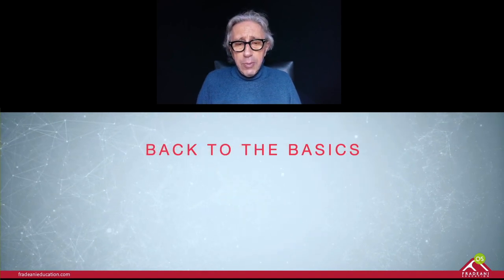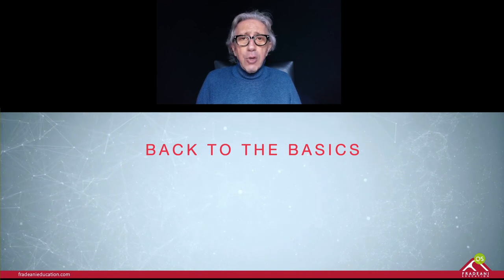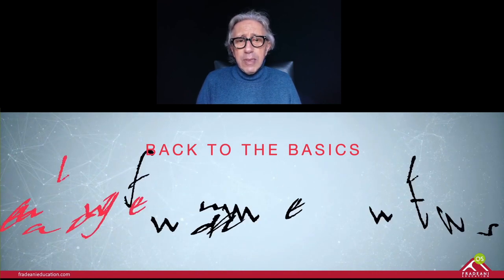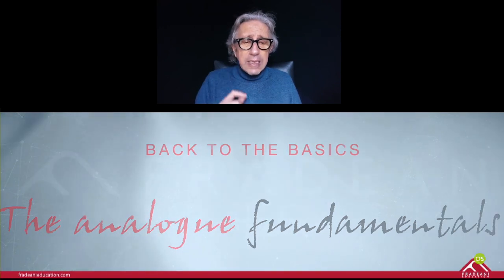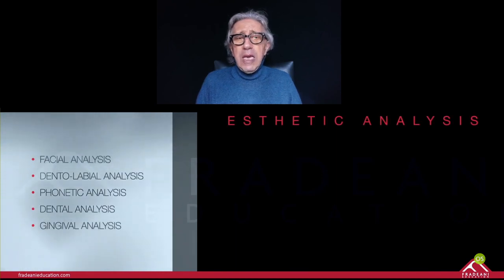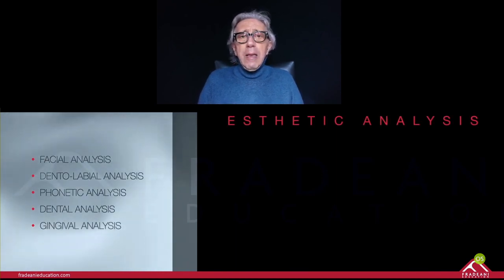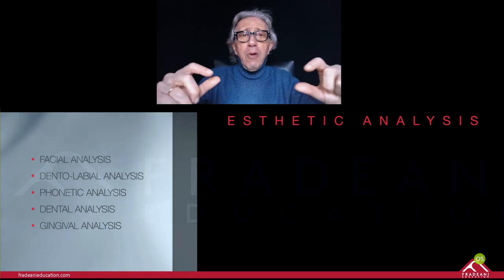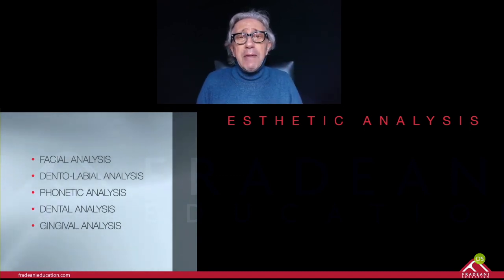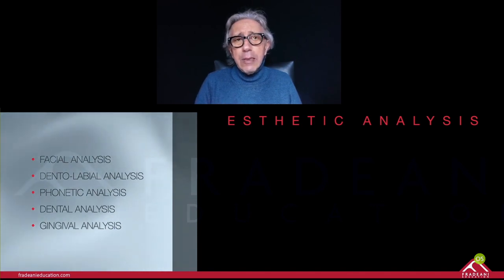So let me go back to the basics. That is very important, because it is a very normal concept that I believe is important to remember. How to really understand your case, where do you start to analyze your case. As I said before, even today, many people are really happy to show the six upper anteriors and to position on the computer the six upper anteriors on the frame of the face. I believe that this is not really well integrated in the real life of this patient.